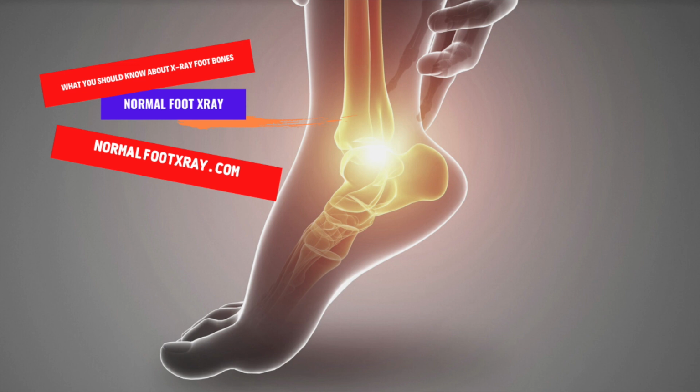The radiologist can use this image to determine if a foot is properly aligned and healed. A physician can also use an X-ray to plan a surgery or check the results afterward. X-rays of the feet can help diagnose cysts, tumors, and infection of the bones. X-rays of the foot are one of the most basic orthopedic investigations. Knowing what to look for is essential to identifying abnormalities in your feet.